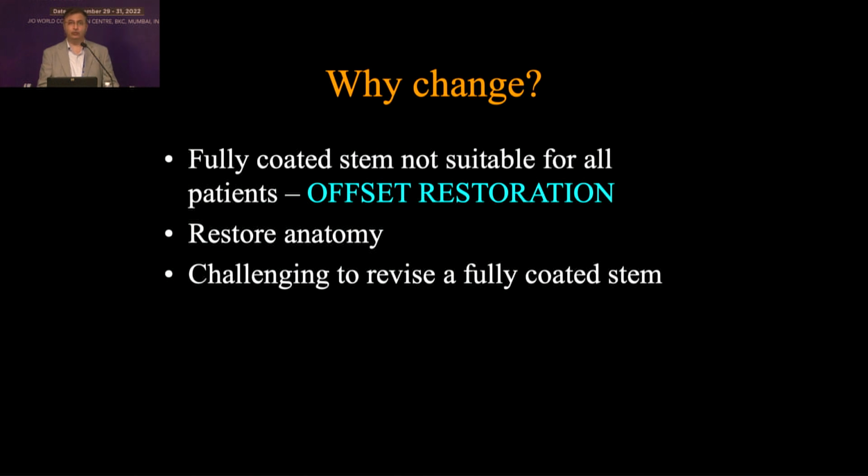So then, why would one at all want to consider a change? Simply because what you need to do is restore anatomy to the patient. It's not about putting in a stem and going home and just giving pain relief. Patients in the modern world want a lot more than a THR.